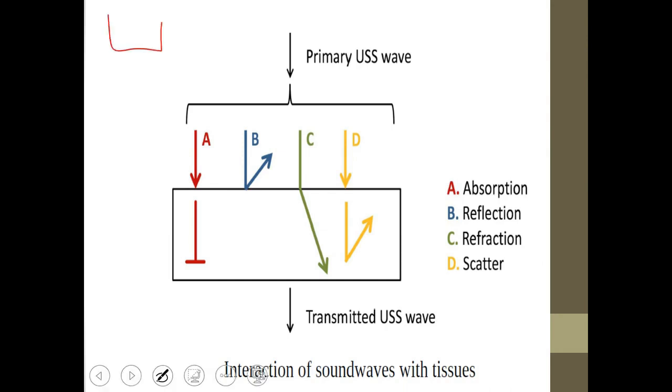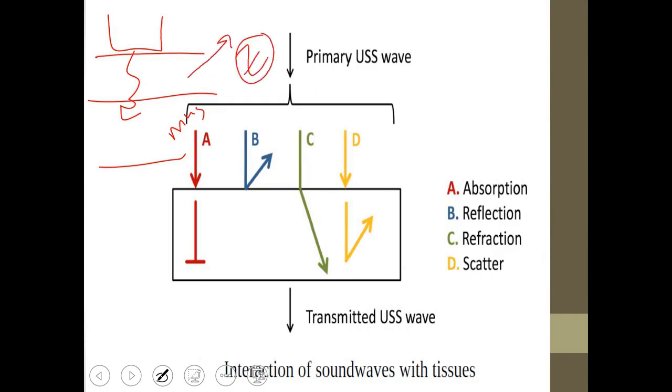If I have a transducer here, and it emits a certain pulse, and for example, there is a surface here that is soft tissue, and I also have muscle tissue, then we have two different tissues present. Each of them has something called impedance, which is the acoustic impedance. This acoustic impedance indicates whether the pulse will travel through easily, or if there will be an obstruction, similar to resistance in transmission, or the movement of the pulse. If the pulse is moving between two media that have different acoustic impedances, reflection occurs. In this case, reflection happens at the surface between them.